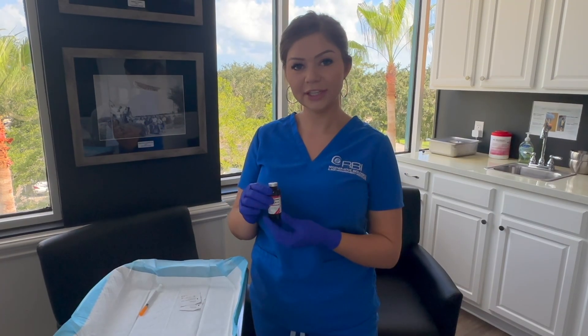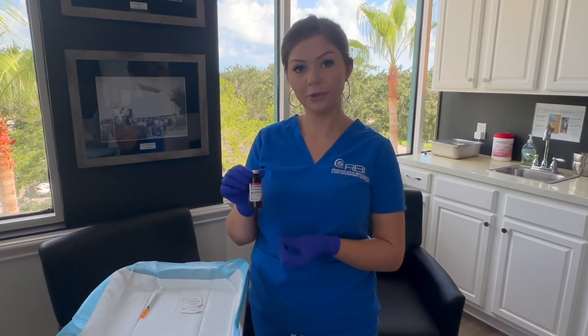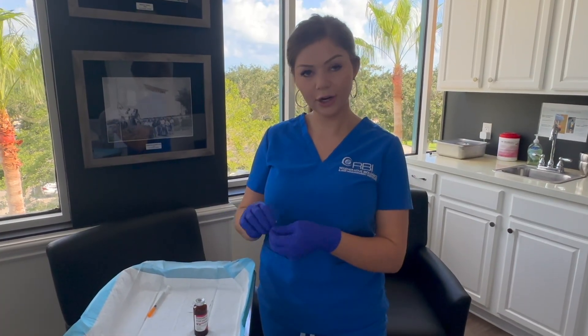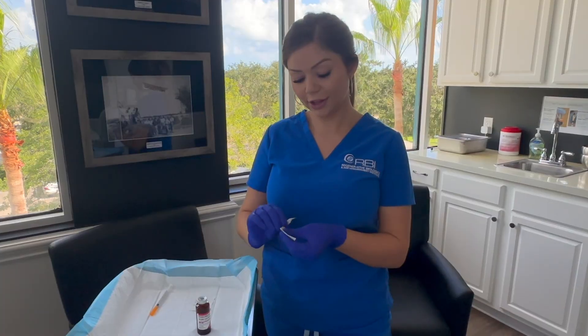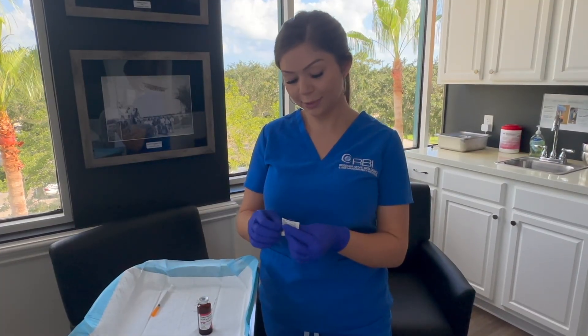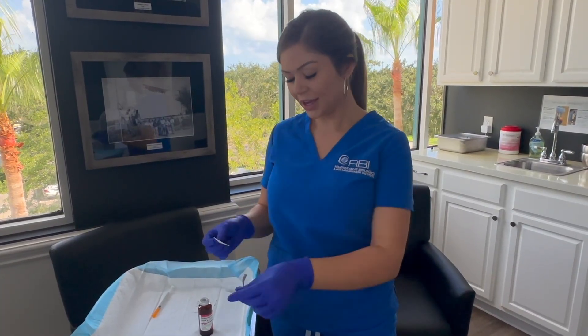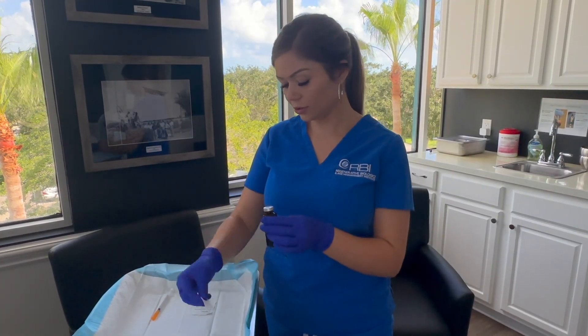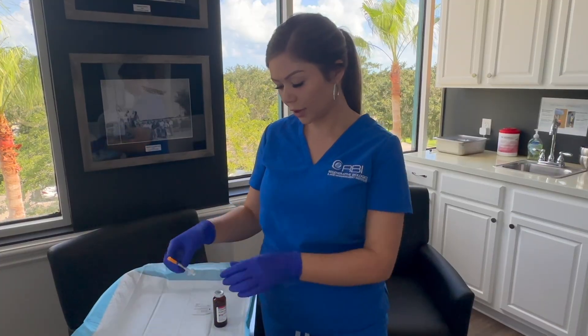I'm going to be explaining how to draw up your B12 medication. To start, you are going to want to wash your hands. I am wearing gloves since I'm here in the medical facility, but you don't have to do that at home. I'm going to cleanse the vial with the alcohol pad first. You can use regular alcohol and a cotton swab at home.